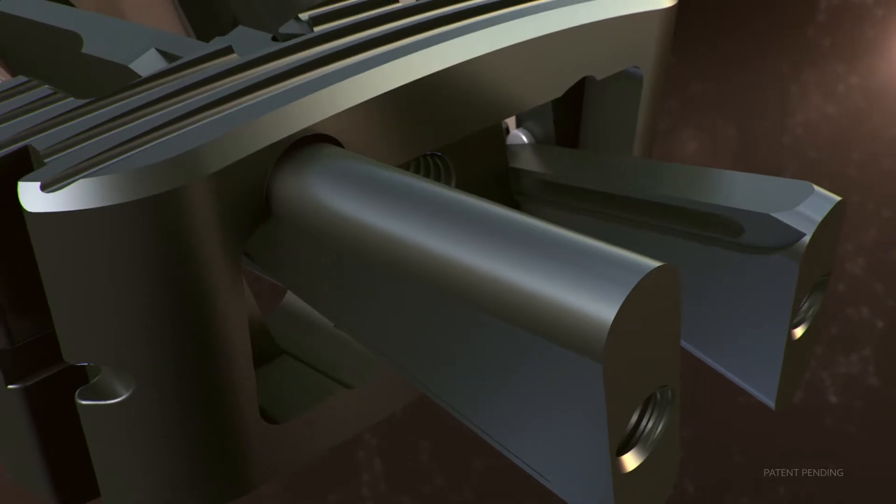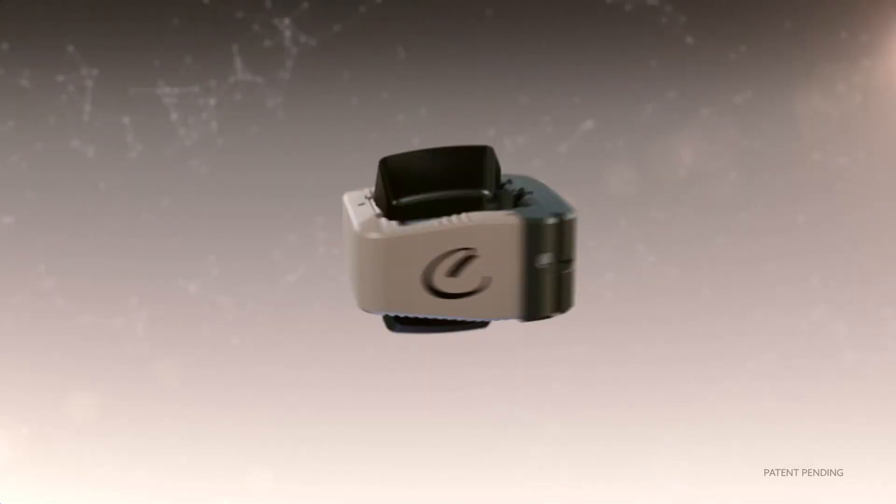The cage allows for one-step insertion, impaction, and then fixation of the blades.